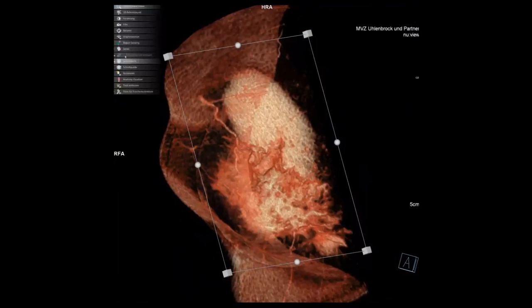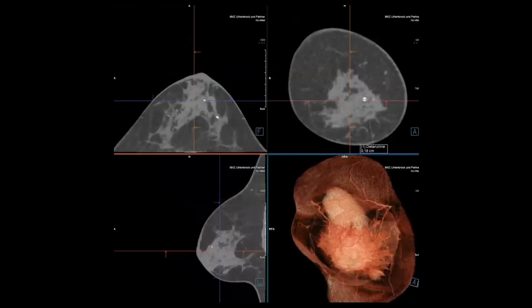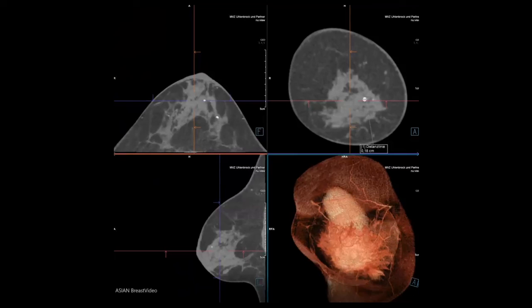Absolutely astonishing image quality in a short examination time. By the way, the radiation dosage of the Mama CT is the same as the corresponding full field digital mammography you've seen before. Thank you very much for your attention and have a good time, bye bye.